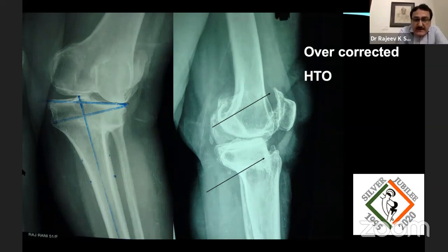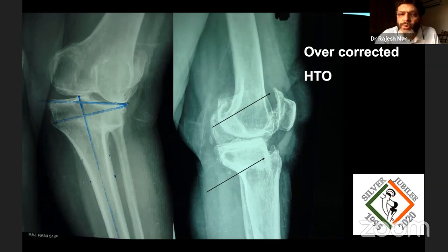Rajesh, in most cases where you have a not so significant deformity, probably you can do the intra-articular correction for these deformities. But where you have an extensive, huge deformity like this, then if you are correcting intra-articularly, we'll be having a lot of problem in the soft tissue balancing. And the only way will be to use a more constrained implant. Yeah, I agree, absolutely.